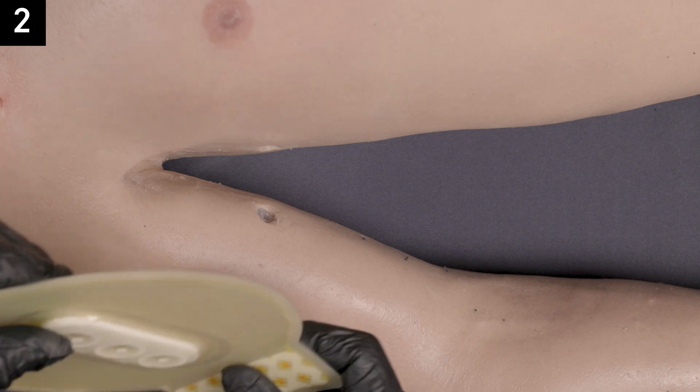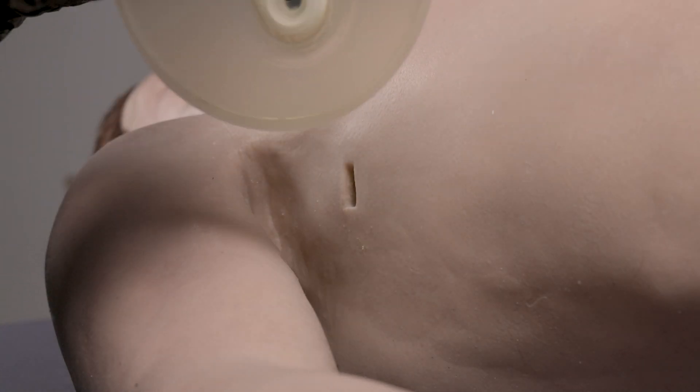Step two: pre-position the chest seal over the center of the wound.